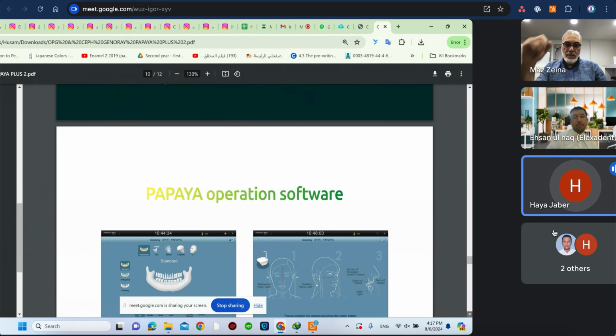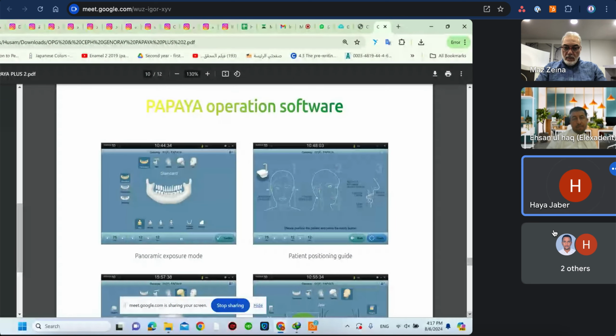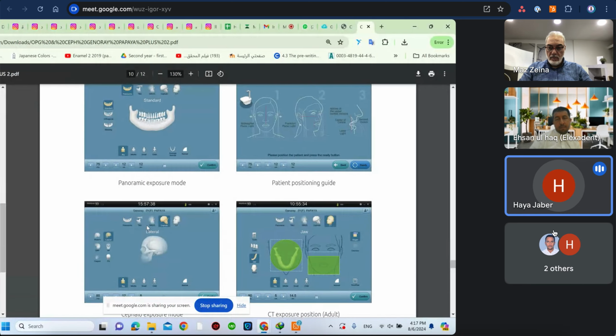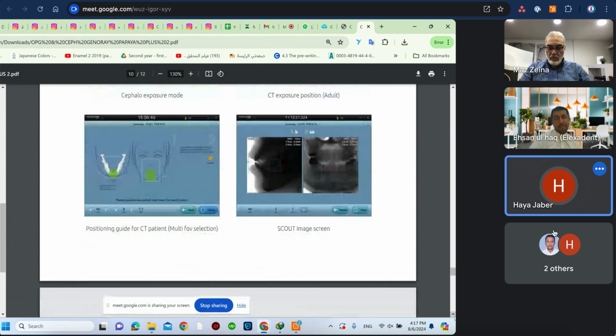And this is the software they use. This is on the computer, all positions. For example, here, I want to get the lateral, the sinus, the TMJ, the panorama, the field of view. I just want the lower jaw. I want the whole face. It depends on the software, which gives some options.